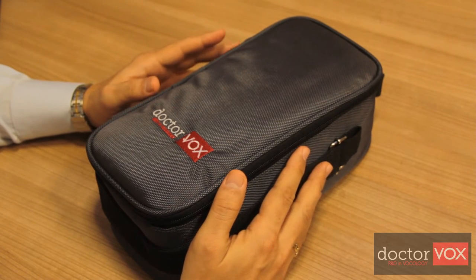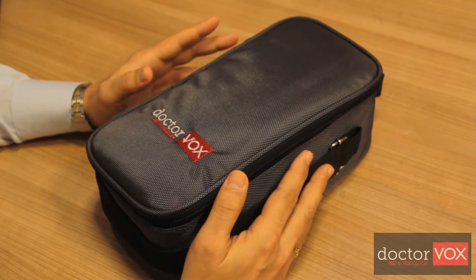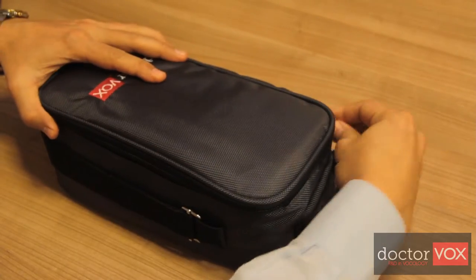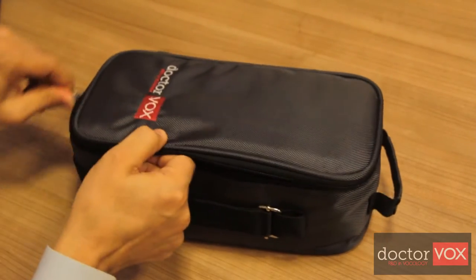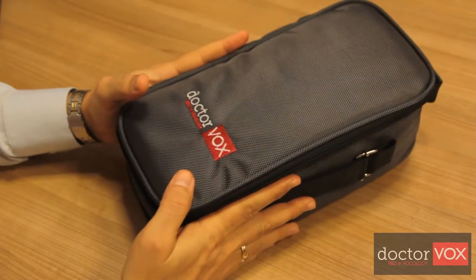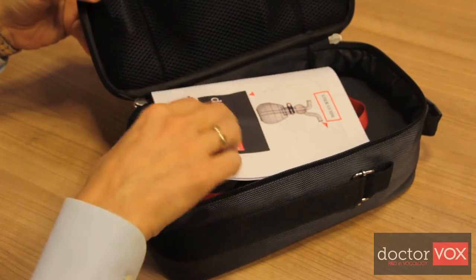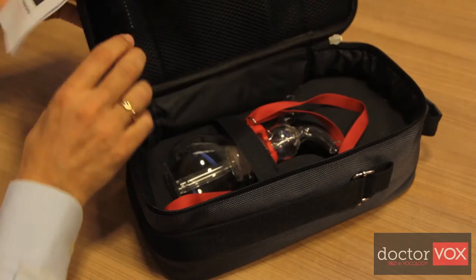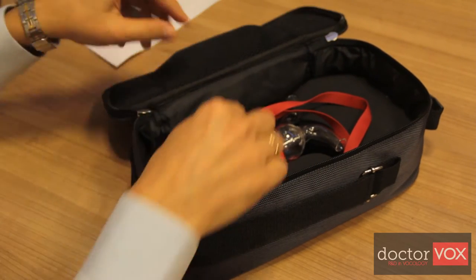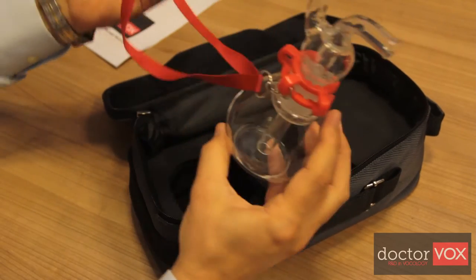The two mechanisms are artificial vocal tract elongation and back pressure. The Dr.Vox set contains a specially designed building bag which carries the parts of the Dr.Vox, a user guide, and the Dr.Vox device.